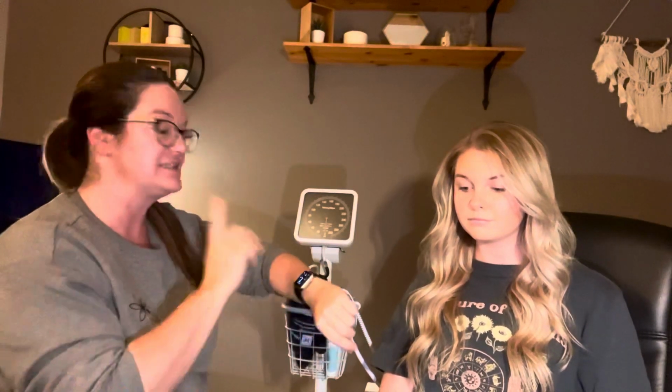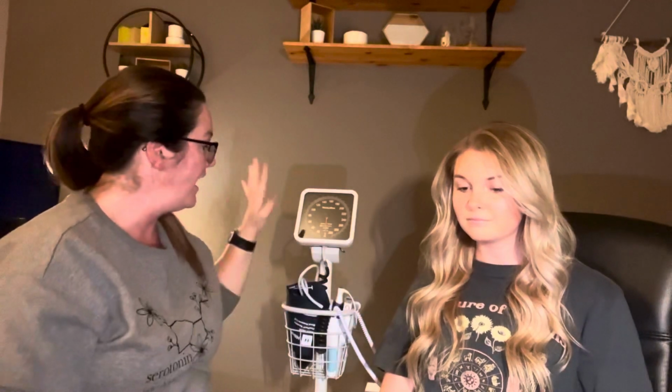All right, so first thing I wanna do is start with hand hygiene. So I'm gonna wash my hands and I'm gonna make sure that I have all the supplies that I need in order to obtain a set of vital signs. So some of the supplies that I need is a watch with a second hand, I need a blood pressure cuff, I need a stethoscope, and I need a thermometer.